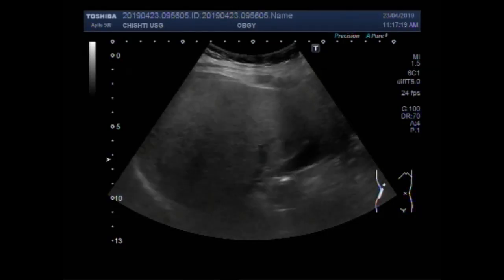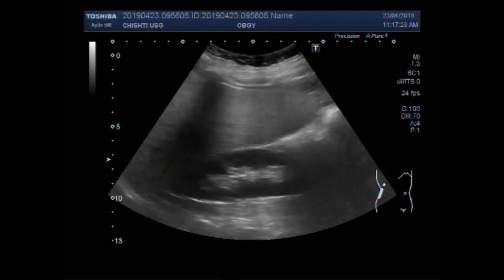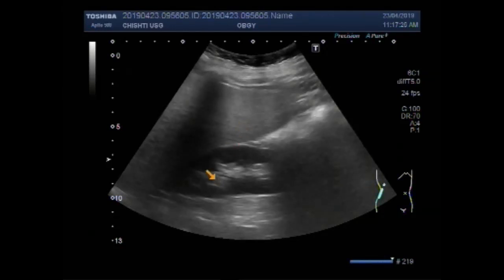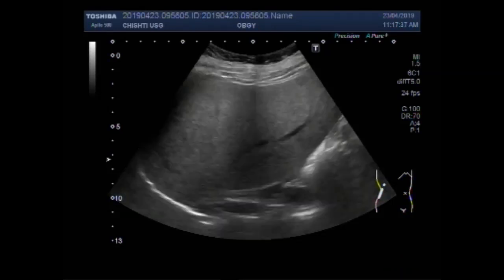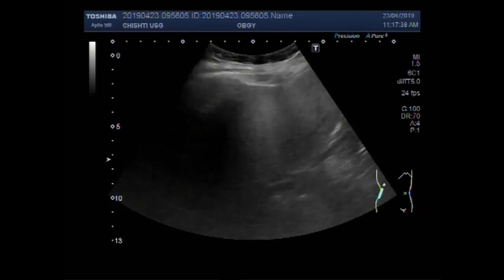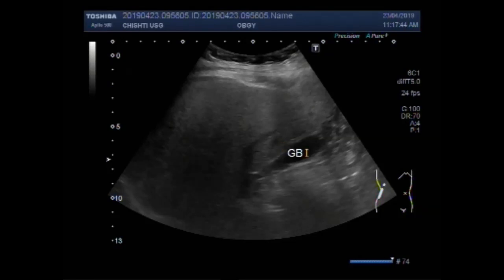You can see the liver and right kidney. This is the right kidney. This is the liver. And this is the gallbladder.